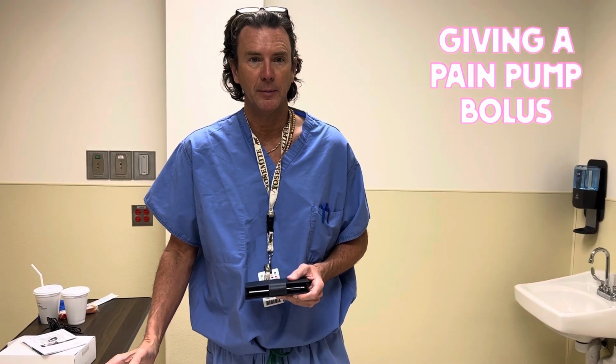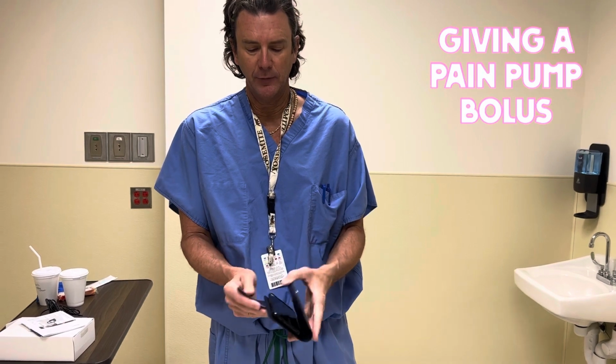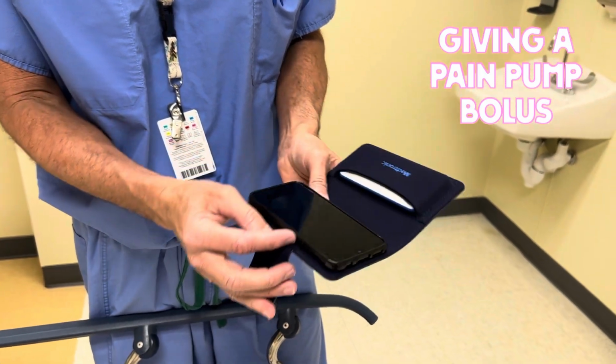So this video is to help patients understand how best to use their handheld device after they have a pain pump implant. They get this little packet that has two devices in it. In the packet, there is an Android phone. This is like a normal Android phone that turns on with the little button on the side.